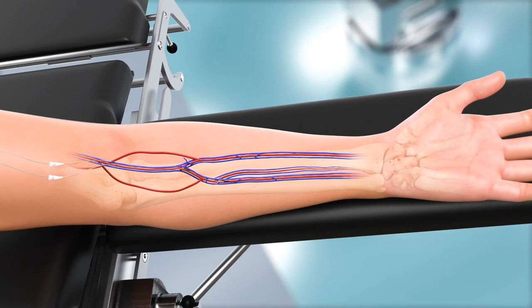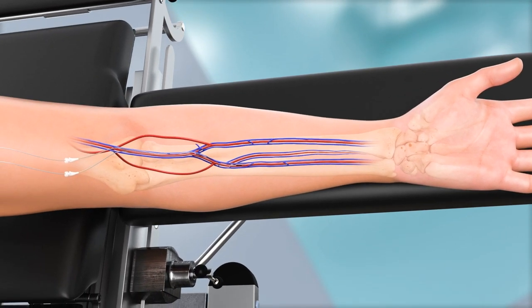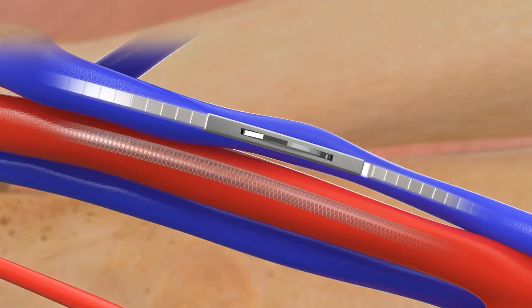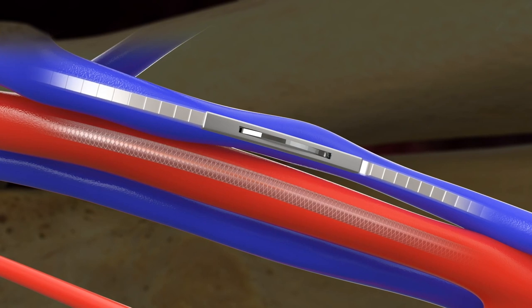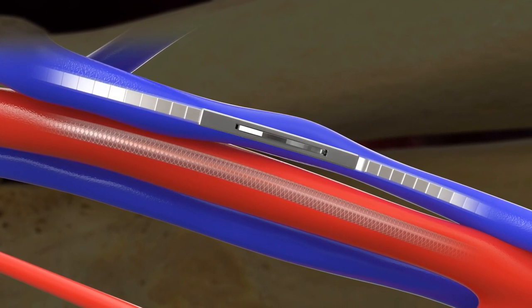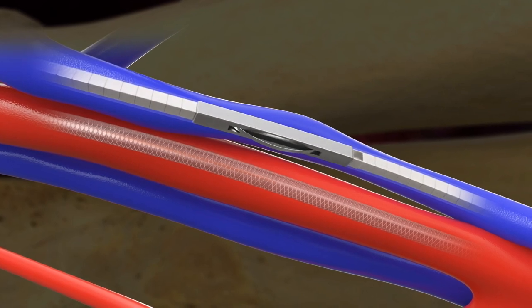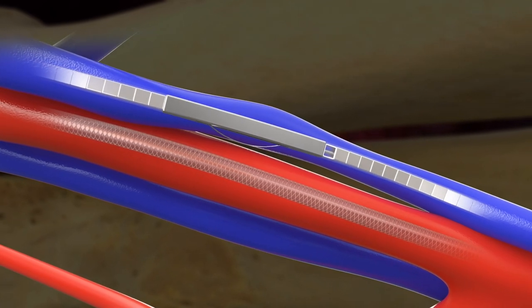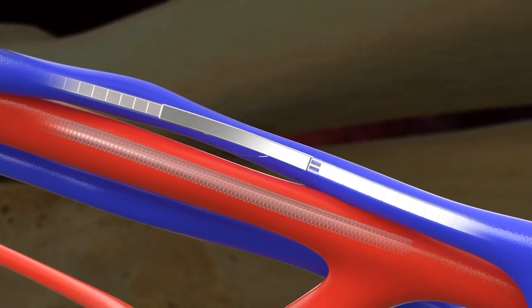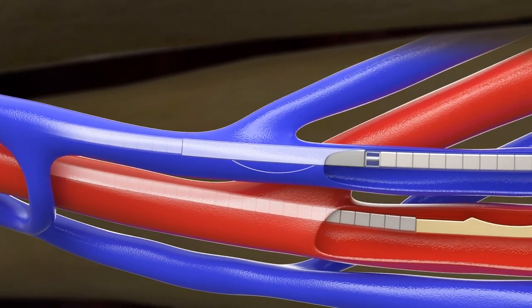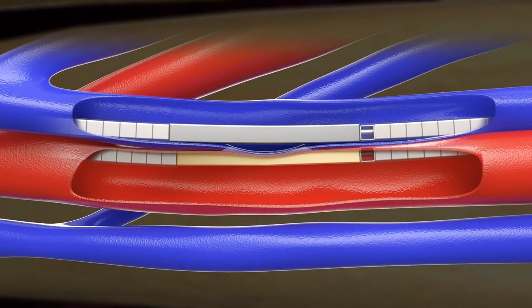Next, advance the venous catheter over the guide wire and through the venous sheath into the brachial vein. Under fluoroscopic guidance, advance the venous catheter toward the target Endo-AVF creation site. Before the magnets engage with the arterial catheter, rotate the venous catheter until the rotational indicators appear as open boxes and the arc of the electrode is pointed toward the arterial catheter. Once correctly aligned, advance the venous catheter until the arc of the electrode sits within the concave surface of the backstop on the arterial catheter. The electrode should appear compressed. Both catheters contain a series of magnets that allow them to co-opt and maintain proper rotational alignment to one another.